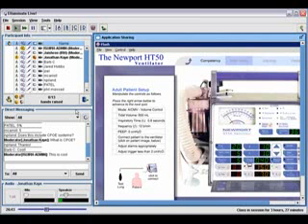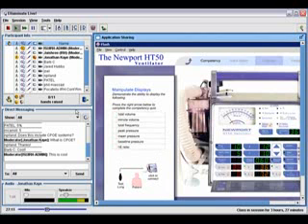So they have to know to actually put that there. They've got to set the machine properly to that, and other things. Inspiratory time at 0.8 seconds. I'll put that there. Now when they think they set it up properly and want to get graded by the automatic scoring mechanism, it would tell them which ones they passed or not. And if they pass, they can print a certificate, or it can be sent to a database so that the hospital manager, the department manager, can track whether people have done what they needed to do.